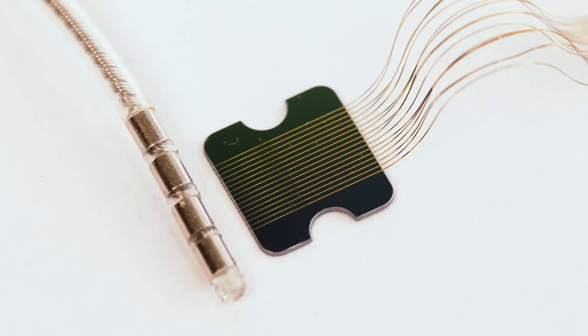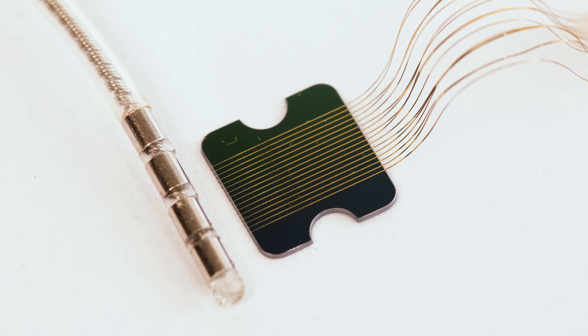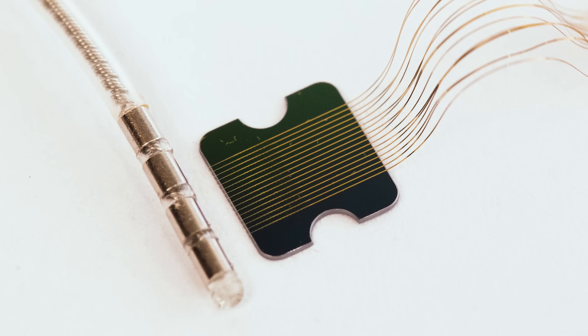Let's talk about the threads themselves — those tiny, tiny things. How many are there? There are 64 threads and each thread has 16 electrodes, for a total of 1,024 electrodes capable of both recording and stimulating. The thread is essentially a polymer-insulated wire. The metal conductor is a kind of tiramisu-cake structure of titanium-platinum-gold-platinum-titanium, and they're very tiny wires — two microns in width.